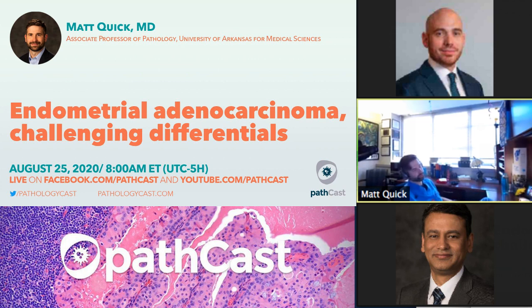Yeah. So if MLH1 is lost, then PMS2 is almost always going to be lost. And I think what you're looking at is an MMR deficient tumor. When I'm working with these diagnostically, I only use the submissive part of the pair. So I'm only going to use PMS2 and MSH6 to diagnose that. But yeah, I think if MLH1 is lost, you're definitely dealing with, I can't say definitely ever, right? But 99% of the time, you're dealing with a mismatch repair deficient tumor.